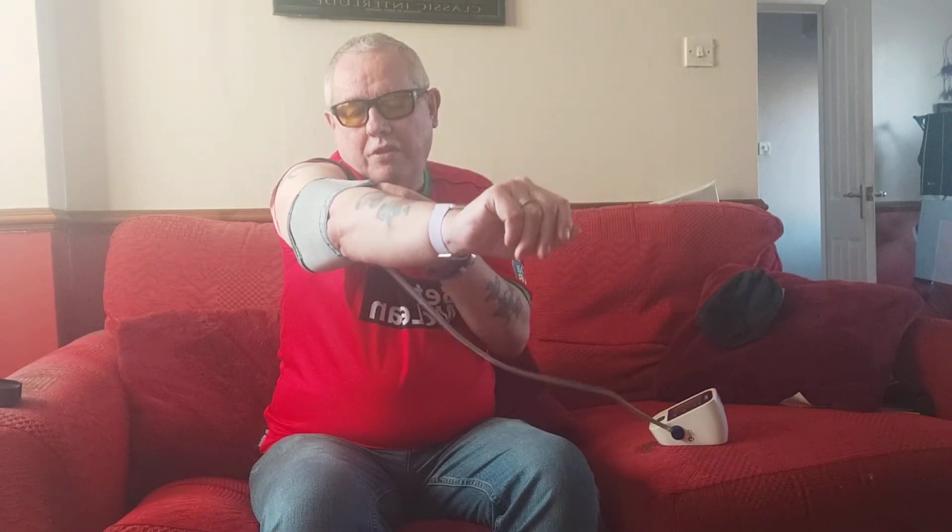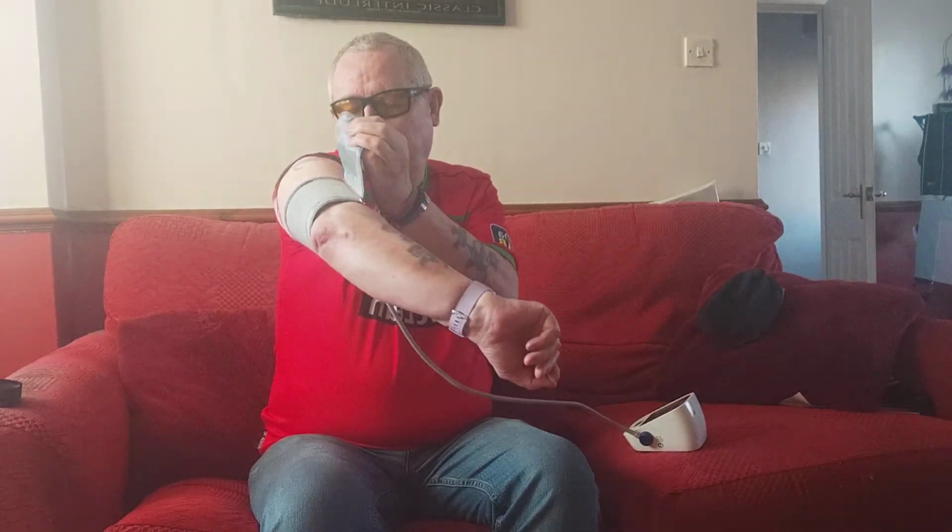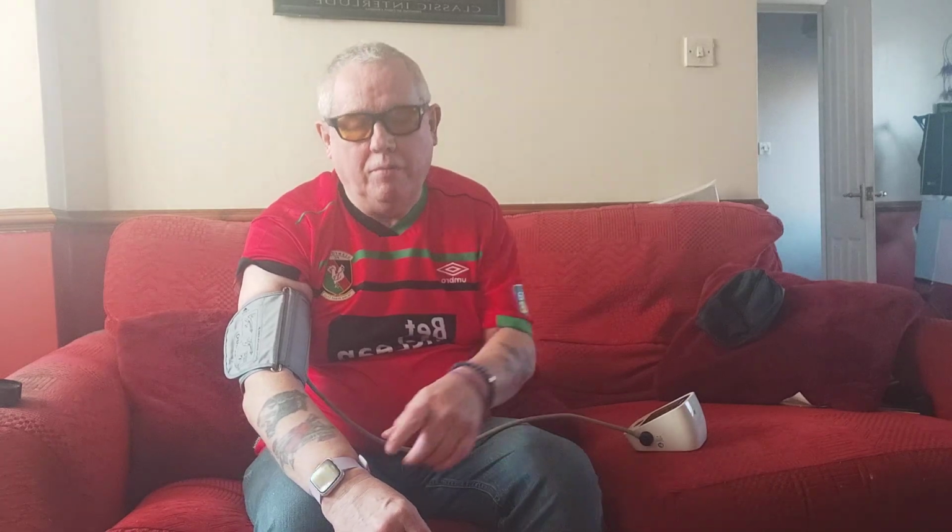I take 1 reading first, and then I take another reading after that, you know. So there's the blood pressure. See how easy that was? That's it done in seconds. Now, when I'm at the doctor's, I'm sure when you're at the doctor's, you're just sitting there with your arm resting like that. And a lot of people say, you know, you should get your blood pressure. That is how you get your blood pressure taken.